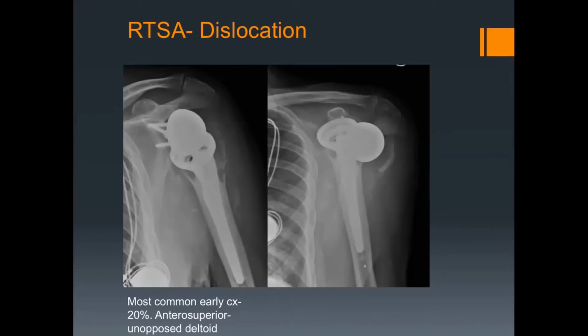Another one was using a new prosthesis where, to be honest, it was probably my own surgeon error that meant it dislocated, and we revised it by altering those components. But it was done for a chronic dislocation, so the risks are higher there. And there was one other, I can't remember the details. Unless they've got a funny movement disorder or something else strange going on, these glenospheres are quite big, so I personally don't think these should be dislocating at that rate at all. Okay.